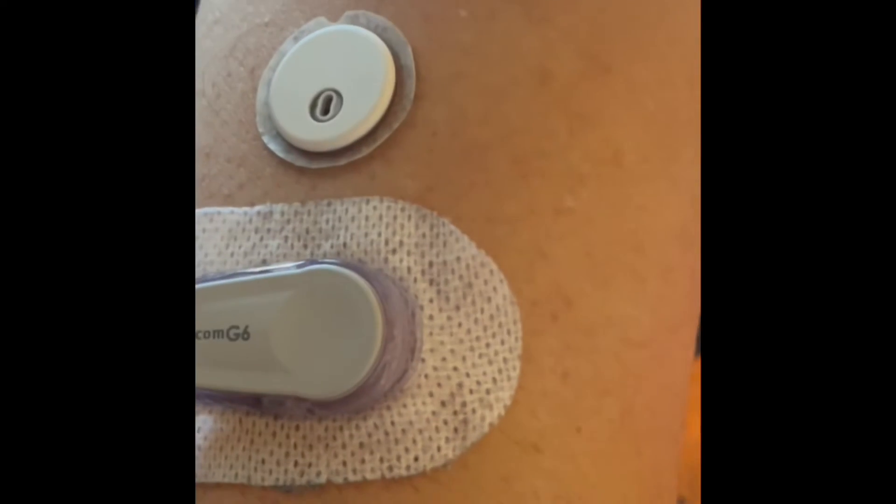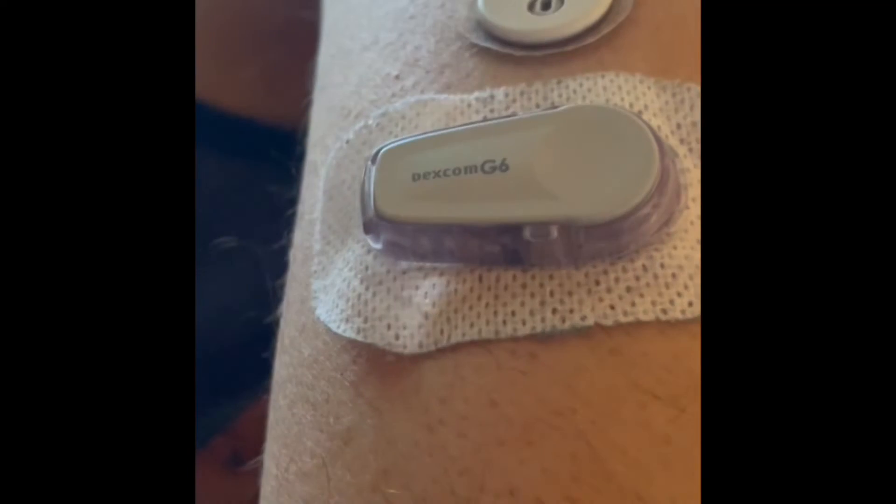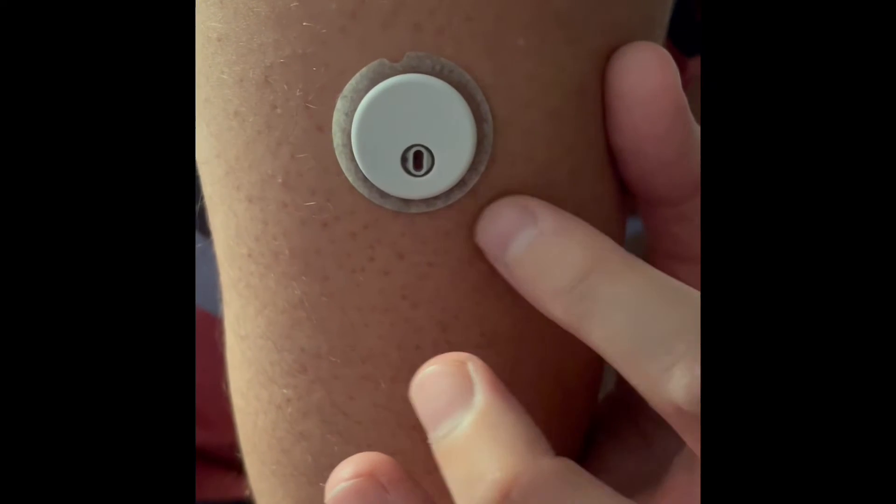One of my concerns was whether, because of how small it is and how little adhesive there is, this thing would actually stay on my arm for the full 14 days. The Dexcom has a nice wide stretch of adhesive and I never had problems with it falling off. I was hoping the Libre 3 would hold up. I'm glad to report that despite catching it on a doorknob, pulling it with my shirt, and bumping into a wall, it stood the test of time. It stayed on for the full 14 days — starting to pull up slightly at the edges by the end, but it hung in there with no premature falling off.